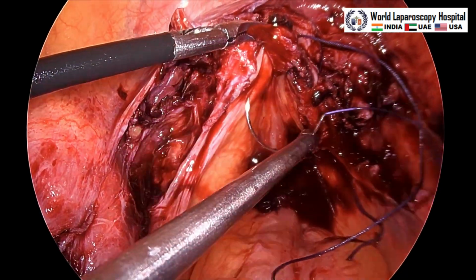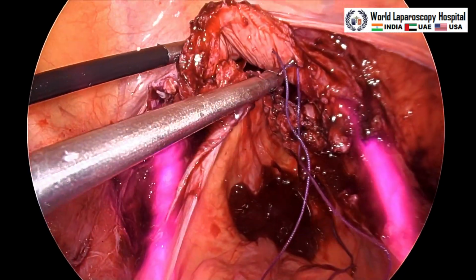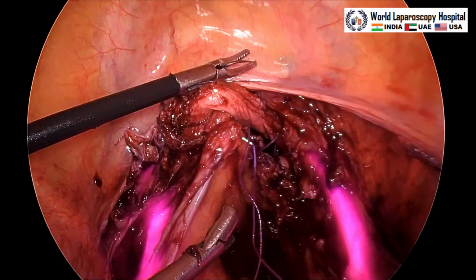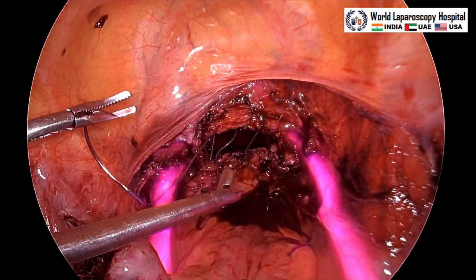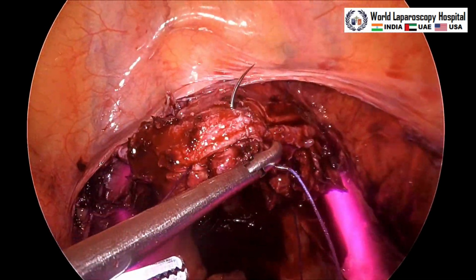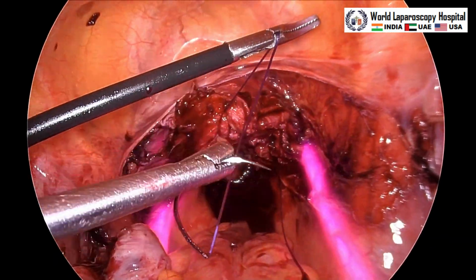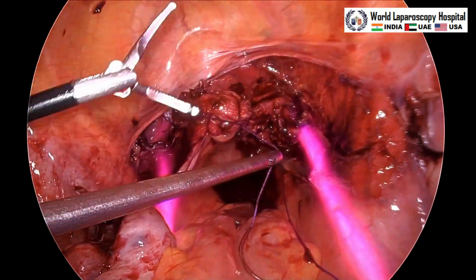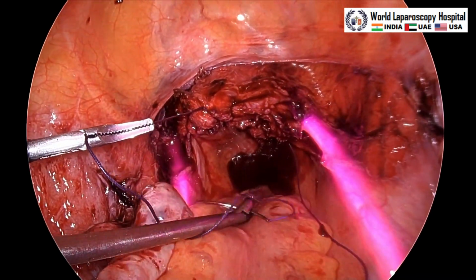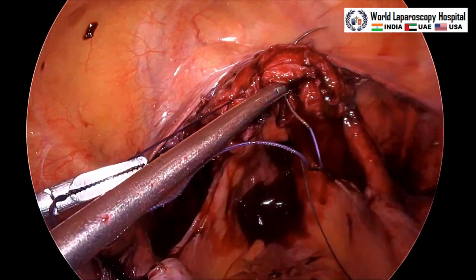And now this is the uterosacral ligament of the left side, and again anterior vagina including epithelium. So once all the 3 bites are taken, at this corner it is better to lock. So you will go with the loop and you can lock it. And now once it is locked, then you can start returning back with the same suture. It is returning. So only 3 bites are taken. The first layer is continuous without locking, and the second layer continuous with locking will be done. So this is going now returning back with locking.